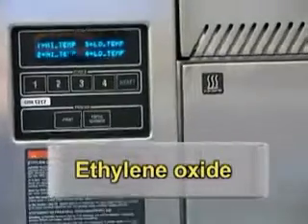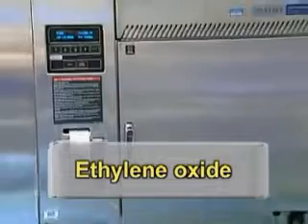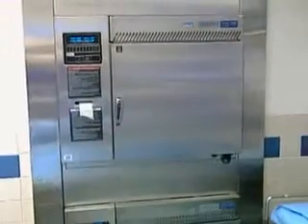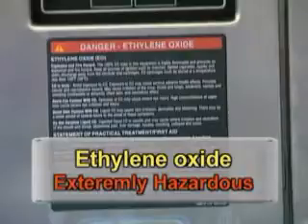Ethylene oxide is a colorless, flammable, explosive gas that is commonly used to sterilize heat and moisture-sensitive items. It is also a carcinogen and mutagen. It is extremely hazardous when inhaled or when it comes into contact with the eyes or skin.